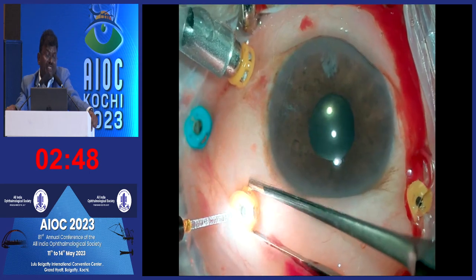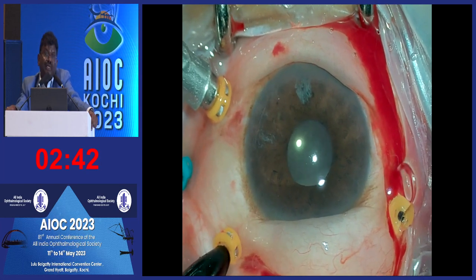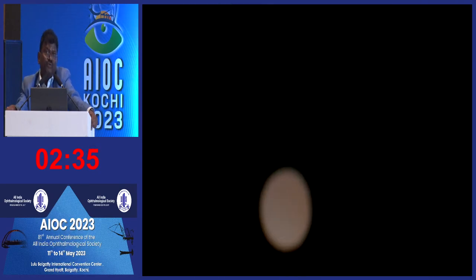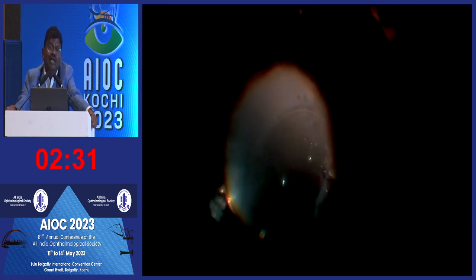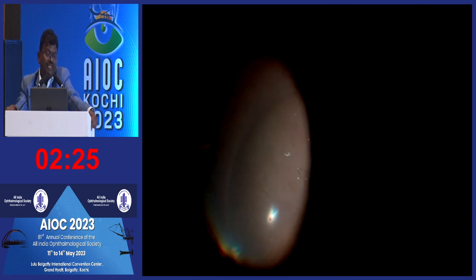In order to make it complete, in one of the ports I put the chandelier so that I can go for bimanual. So through the cannula, you go with the flute needle. Now you inject the PFCL, and whatever the excess fluid in the subretinal space, it is drained through the flute needle, so without making a retinotomy. So I don't need to do any drainage retinotomy in these cases.